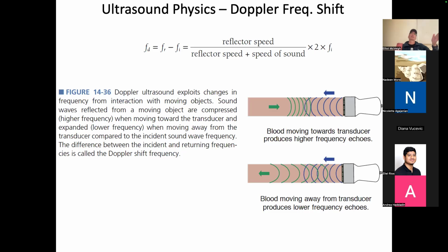You can also imagine you can look at the blood velocity signal as a function of time, integrate that to get how much blood volume is coming out of say, the left ventricle.